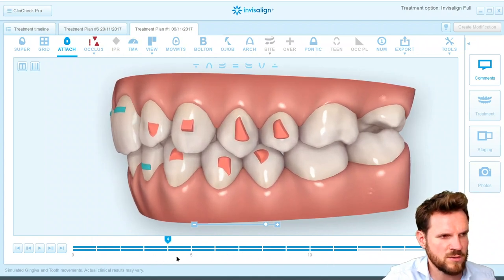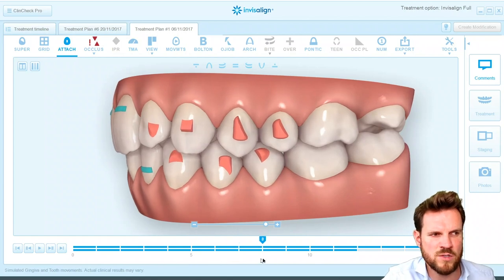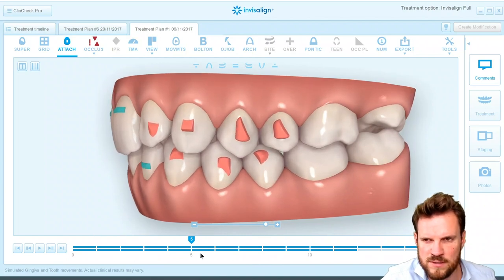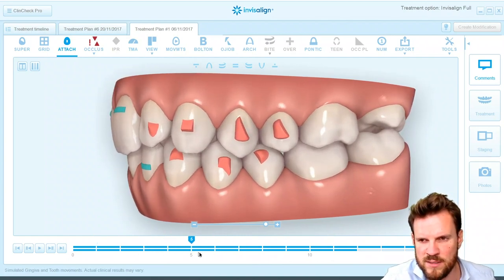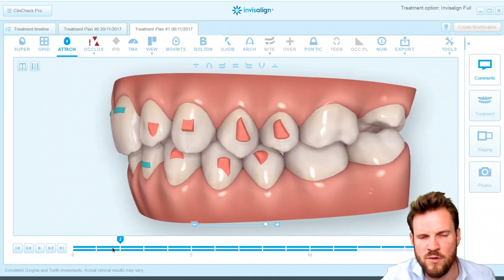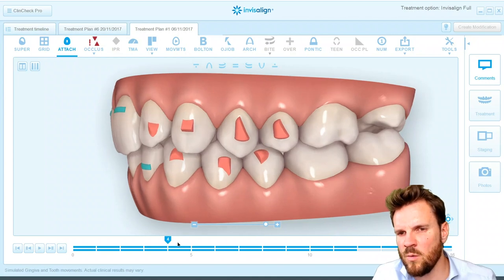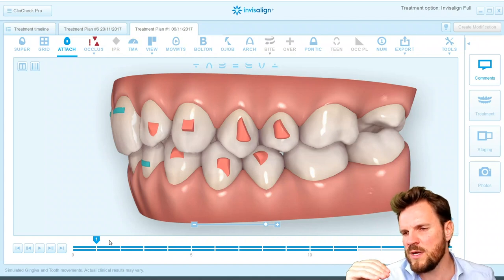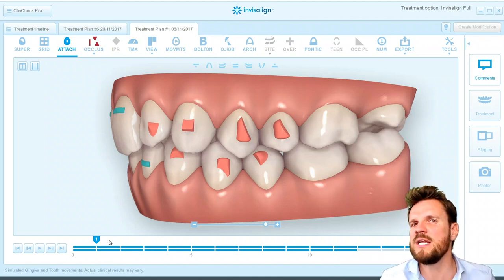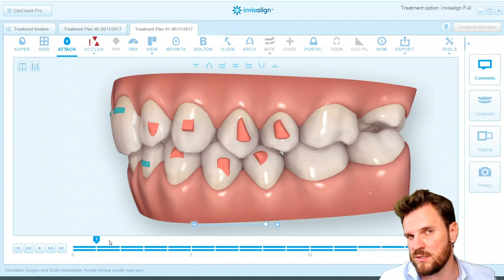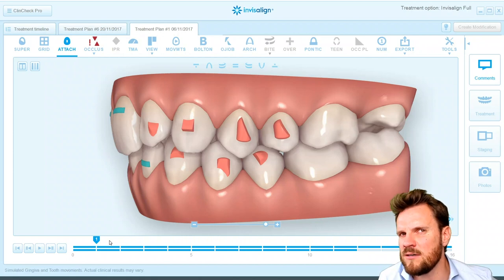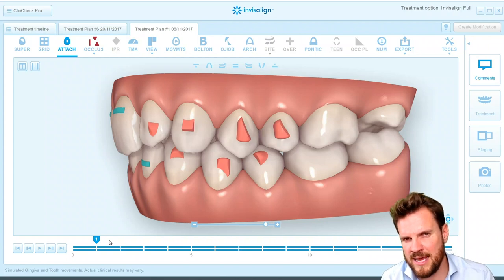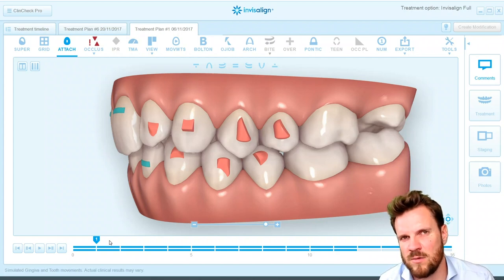Look at the movement: you have rotation of 4, rotation of 5, intrusion of 2.6, extrusion of 2.7, extrusion of 3.6, root uprighting movement of 3.4 — movements everywhere. But the big question is: what is the right priority for this patient? Isn't it most important to get out of the deep bite situation and really achieve lower anterior intrusion? Does it really make sense to have so many movements in the posteriors? And very often you can reduce these less predictable movements — just take them out if they're not needed.